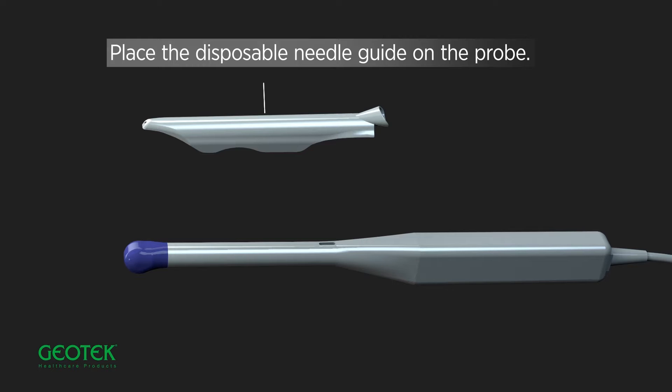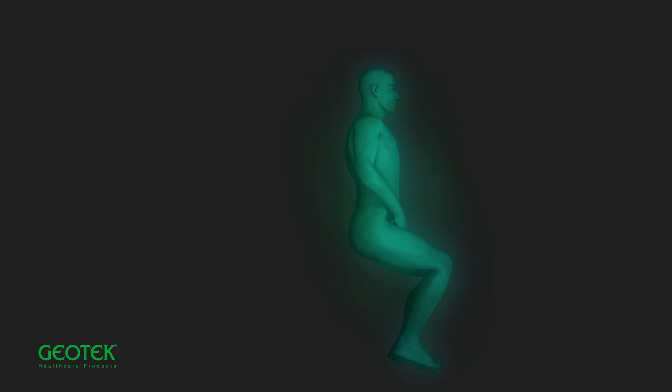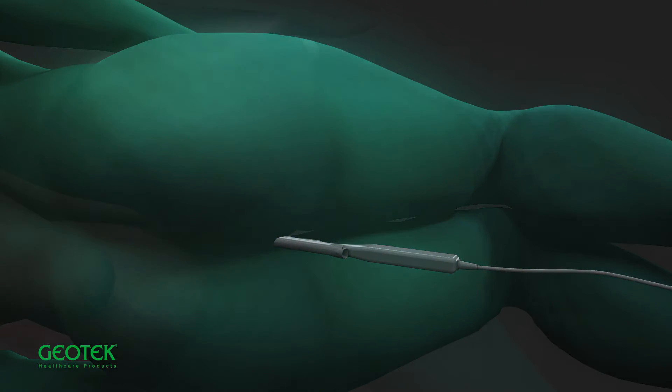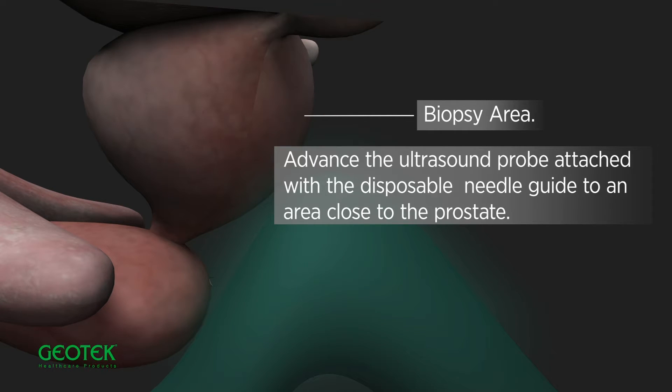Place the disposable needle guide on the probe. Advance the ultrasound probe attached with the disposable needle guide to an area close to the prostate.